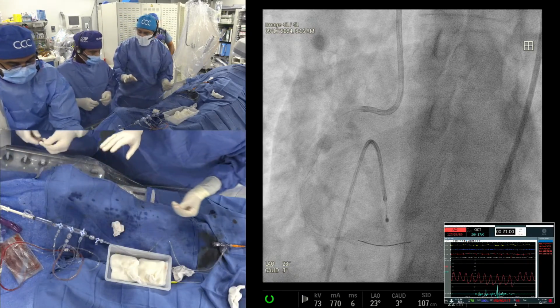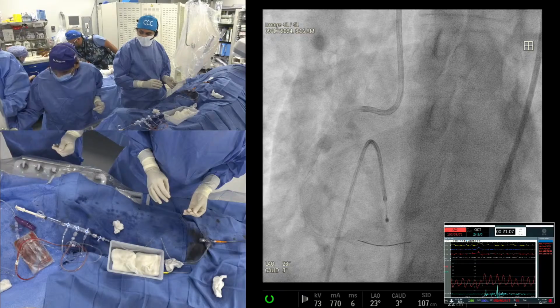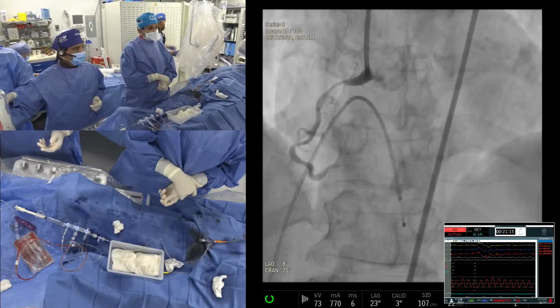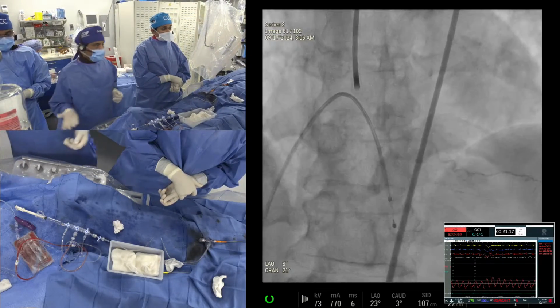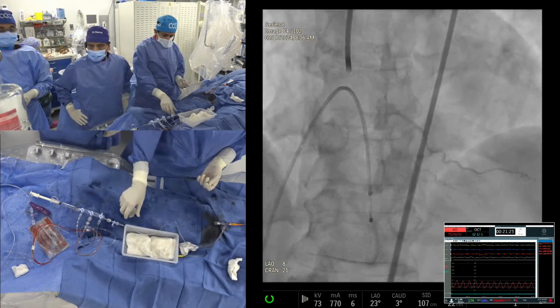The question is how far we need to revascularize this case. So the question was, do we just do the proximal or do we go distal? To me, the question here is, see that very distal also, and then there is a tight lesion in the AV continuation. The patient is young. I would try, if possible, to go to the distal RCA also.